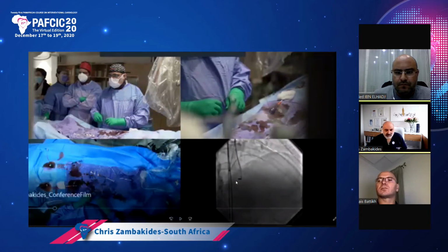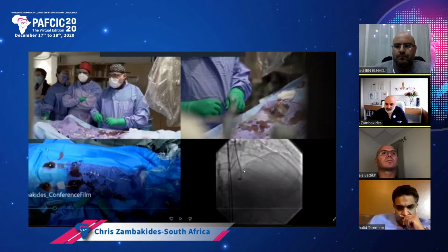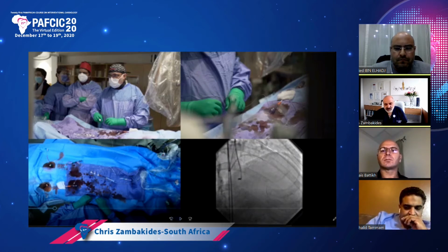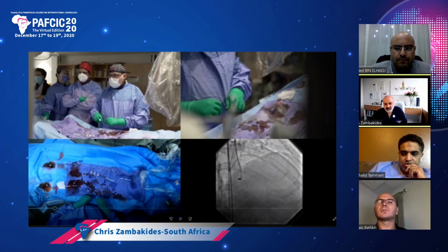The reason why I've left in some of the septal surfing is for the younger operators or people that want to get into CTOs. I think the most important thing is if you can just look at my hands in the different views and see that there's very little pushing, or actually no pushing of the wire. It's all got to do with spinning and rotating the wire. You keep spinning, rotating the wire with very little forward pressure to see if it's going to take any of the microchannels. If you feel resistance, and it's got a lot to do with tactile feedback as well, stop, pull back, and try and find a different microchannel.